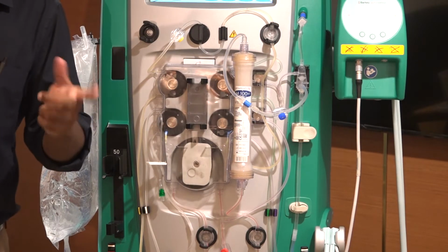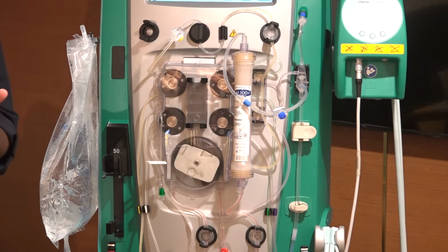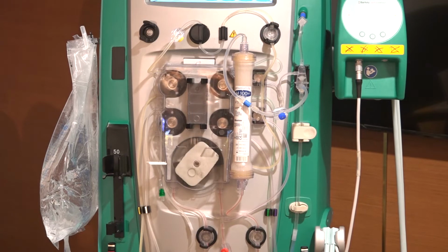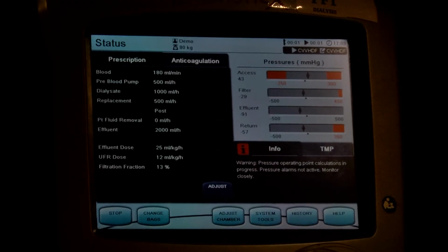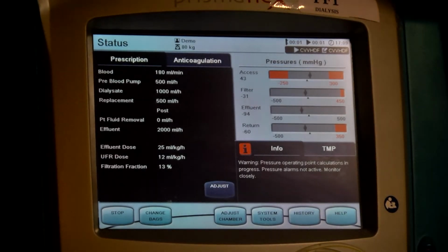So we recommend connecting CRRT input to the positive pressure region of the ECMO circuit, that is pre-membrane or post-membrane, and the CRRT output should be connected to the negative pressure side of the ECMO circuit. That is the only option, pre-pump.